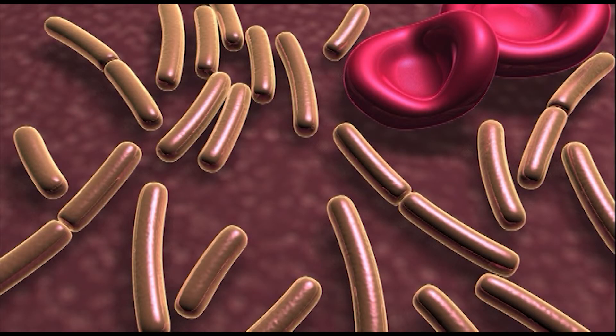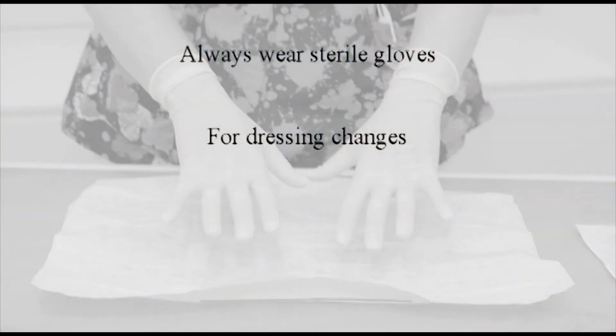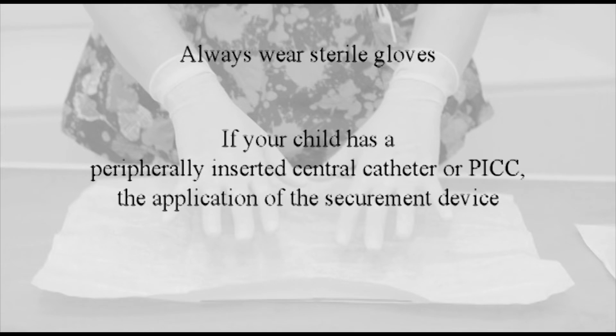To prevent infection while caring for your child's catheter, you must always wear sterile gloves for dressing changes, cap changes, and if your child has a peripherally inserted central catheter or PICC, the application of the securement device.